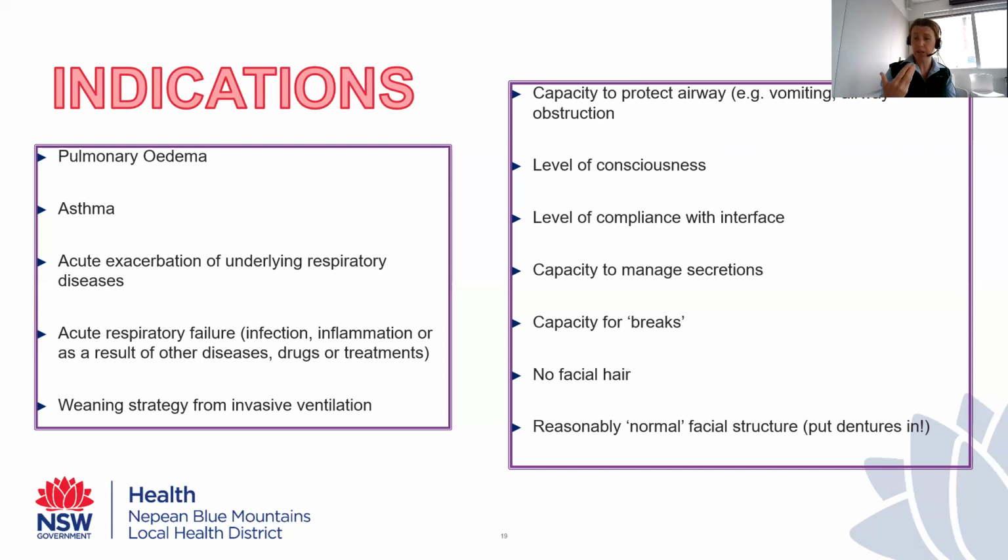So pressure relief, I should say, because these devices are hard. They don't move. They stay in the same place. We need to give the skin a break. But we also need to provide oral care. It's an essential care that we do for our patients, and it's a necessary care. It has its own consequences of not doing it, and it's important that we do that.